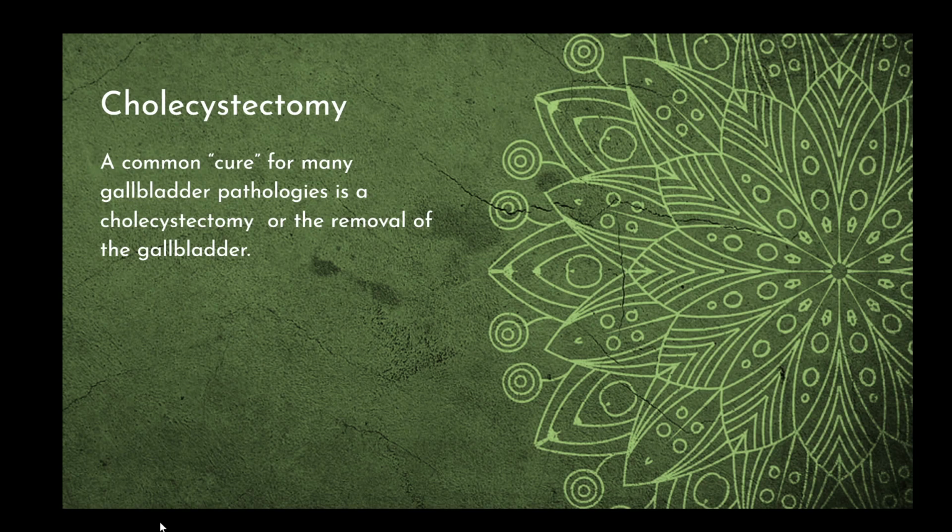So nothing wrong with it. It functions just the same as it needs to in people who have their gallbladder. Everything is fine. It's just a little bit more free flow bile consistently. The only time you get concerned is if that bile duct gets over 10 millimeters or that 1 centimeter threshold.